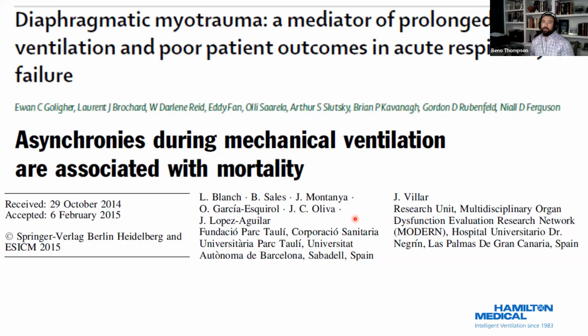And it was not ever a patient problem where they came into the hospital with a damaged diaphragm. That was given to them at the hospital. So myotrauma is almost always an iatrogenic injury, right? It's given to them at the hospital. And it's done by setting them on ventilator settings that they're not comfortable with, and they fight the ventilator. Just think, if you set me at 400 cc's and I want 600, am I going to acquiesce to the ventilator when I don't get that 600 and say, okay, I'll let the ventilator do whatever it wants? No, I'm going to struggle and try to get that 600 that I want.